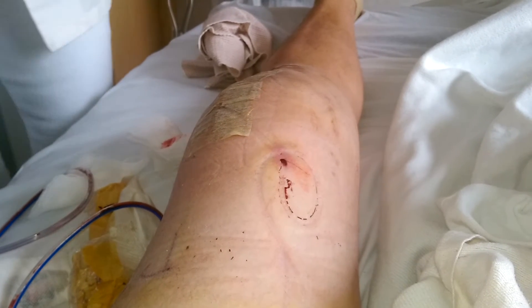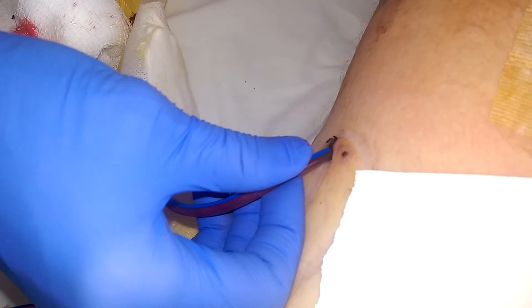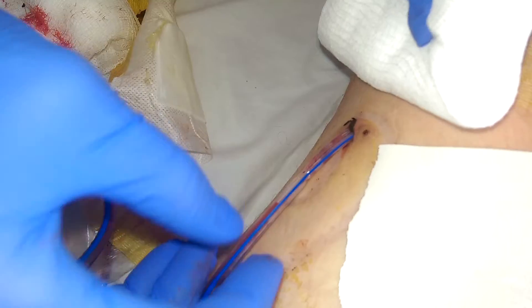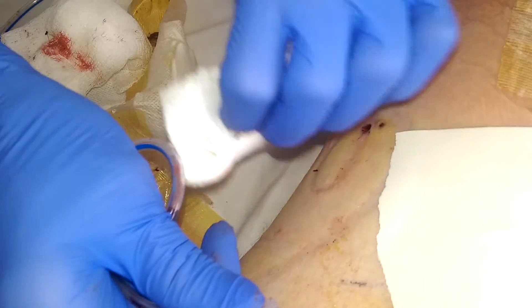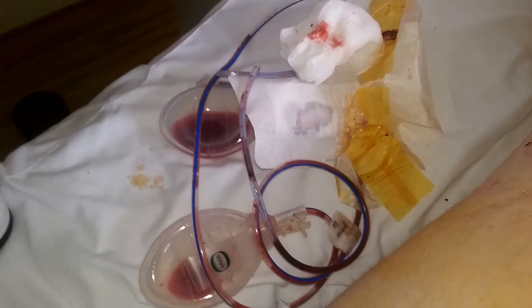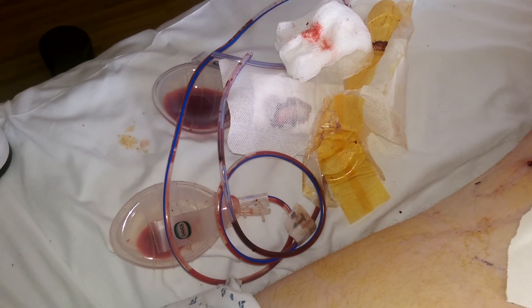So we're going to pause it there for a second. Ready? Okay. One, two, three. Don't hold your breath. No holding your breath. There it is. There it is in there a little ways. Perfect. And now there it is. All that inside a knee. Amazing, isn't it?